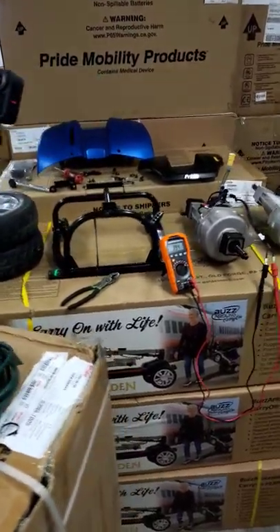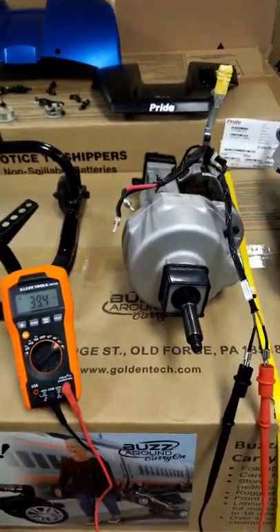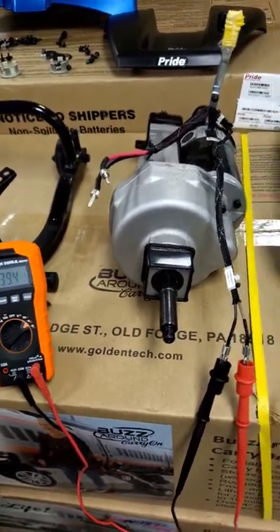Hi everyone, I'm Drew with Mobility Direct. We are back here again. I just wanted to give you another quick video on how to test the motor brake on your mobility scooter.